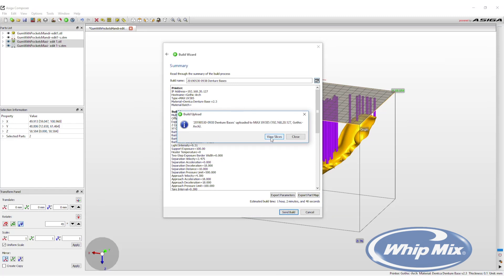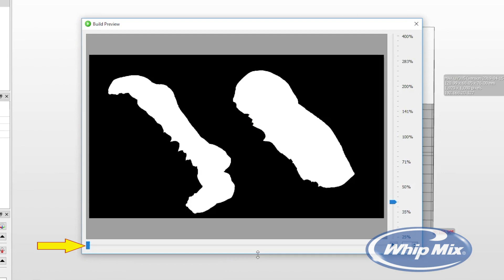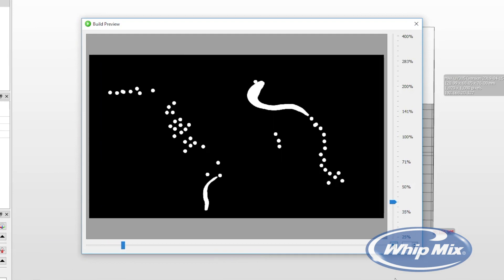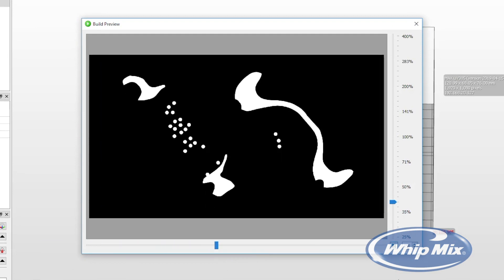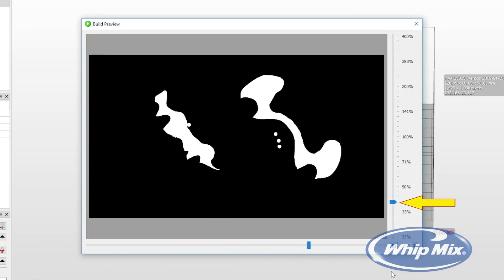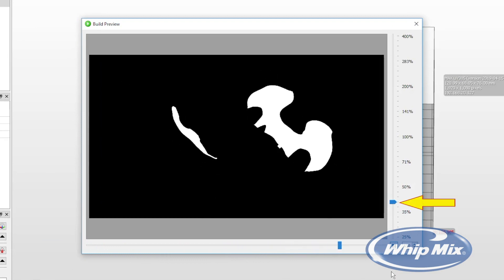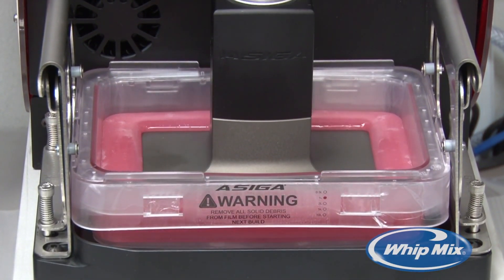When the build is submitted to the printer, the slices or layers can now be viewed. In the build preview, the progress arrow along the bottom of the window can be moved to see exactly how the layers will be built in the printer. The slide on the right side allows you to zoom in and out of the print preview. The printer will now complete the print process.